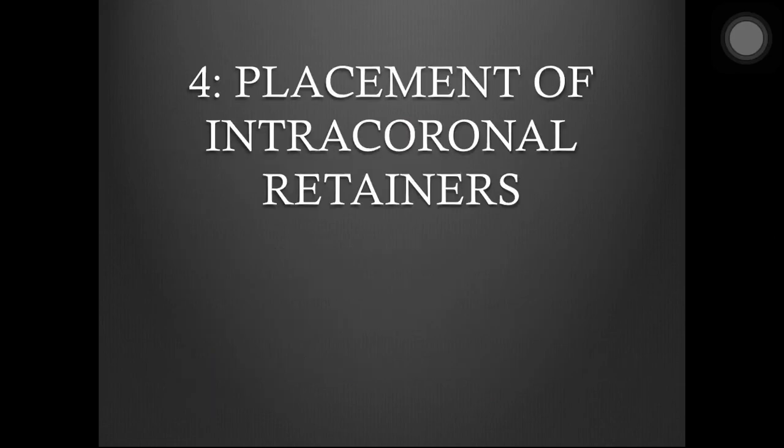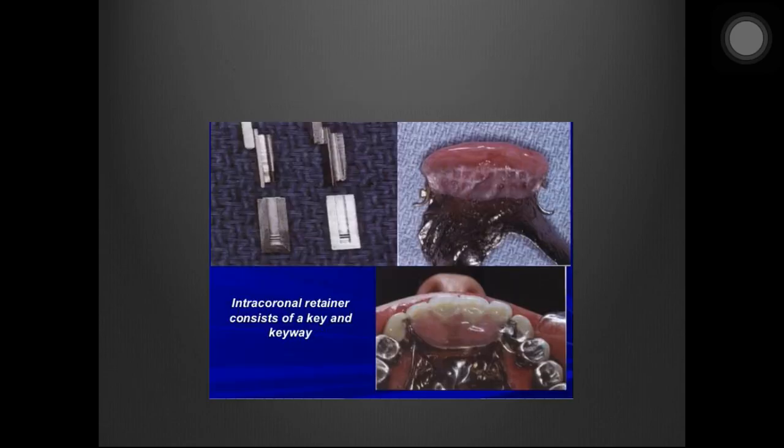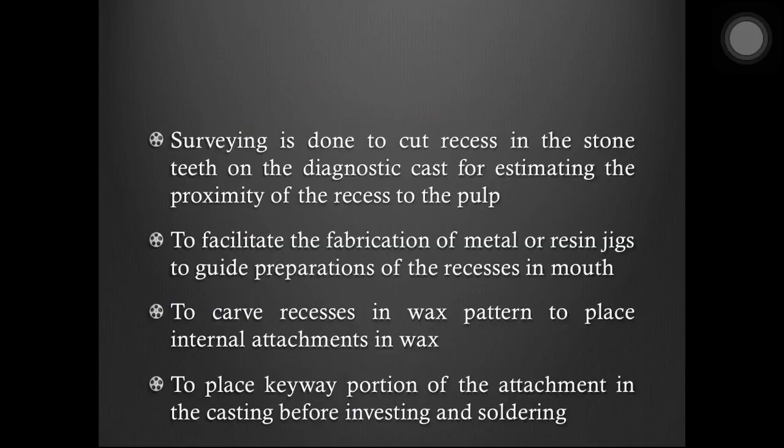Another purpose of the surveyor is placement of intracoronal retainers, which we know are aesthetic replacements of extracoronal retainers. They are semi-precision and precision attachments which are used to enhance retention and resistance.